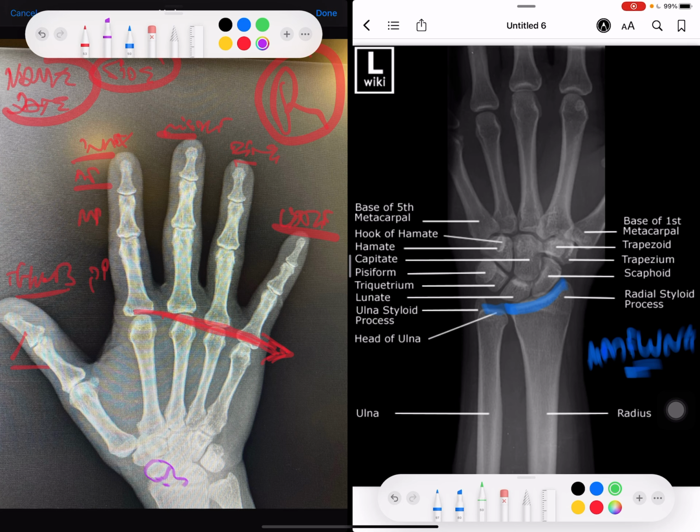And if the fingers are not pointing, they're rotated, then we know that there's a fracture that needs reduction and surgery, because if the bones all are aligned, they still point to the scaphoid. See, like this, you're good. When you flex the fingers, they should all point to the scaphoid. If they're like this or they're twisted, then the bone is rotated.